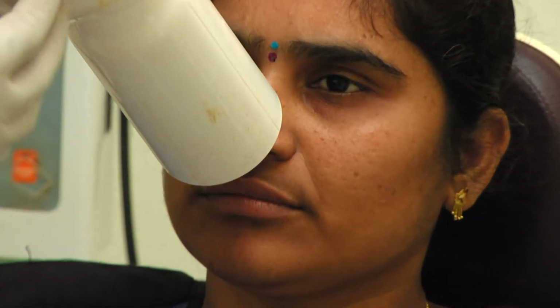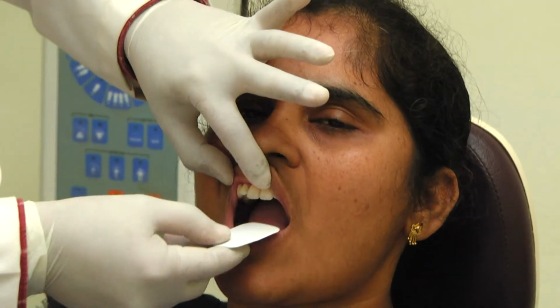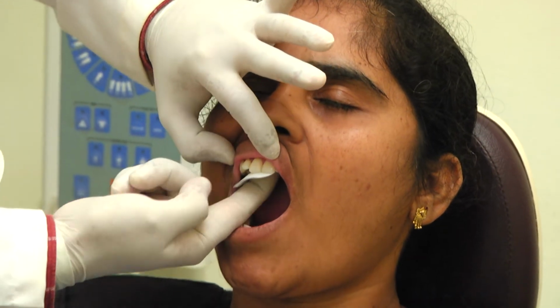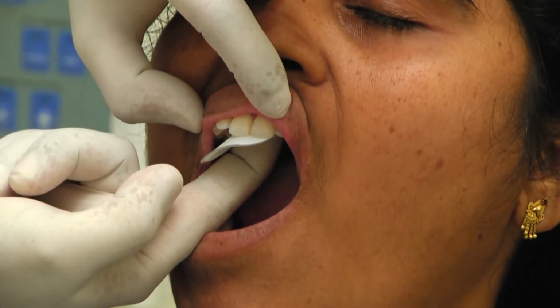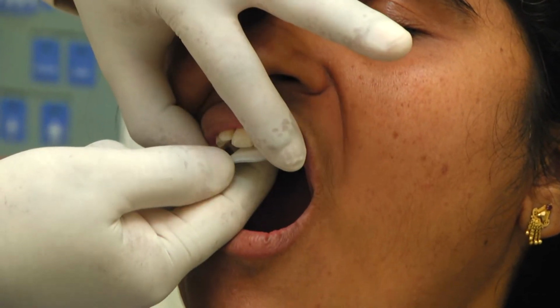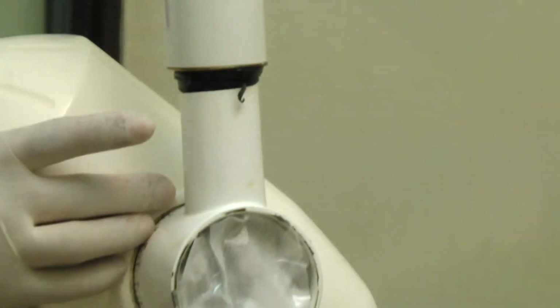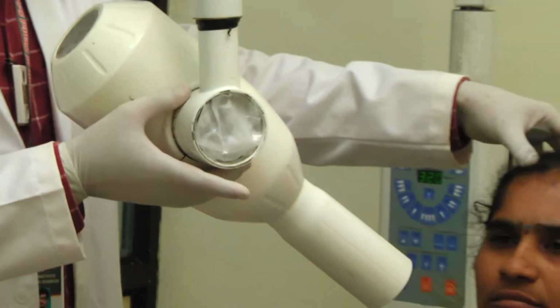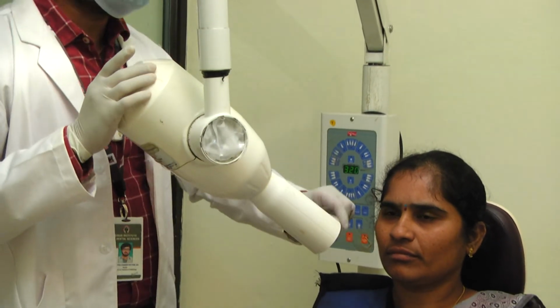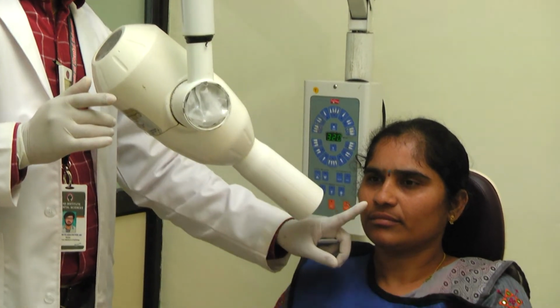For maxillary lateral incisors, again the placement of the film is the same, and exactly the region of interest should be in the center of the film. This is how the placement of the film is done, and ask the patient to hold it with the index finger or the thumb for the maxillary anteriors. Once the placement of the film is done, again adjust the vertical angulation, that is plus 40, and then the point of entry is similar to the central incisors, just above the level of the upper lip, 1 centimeter from the midline.